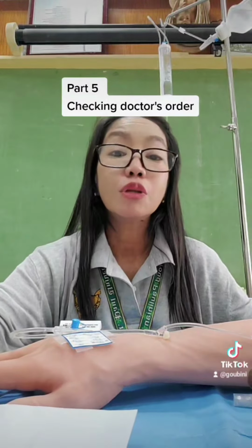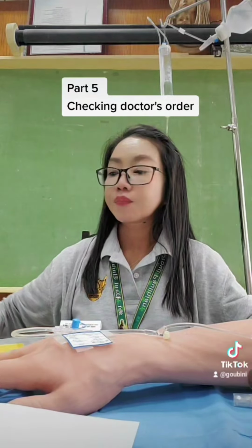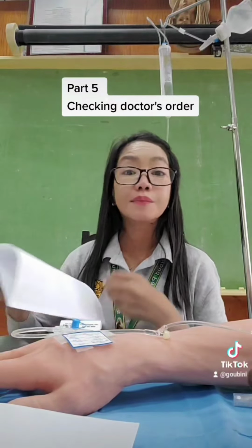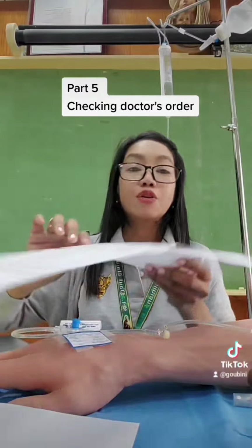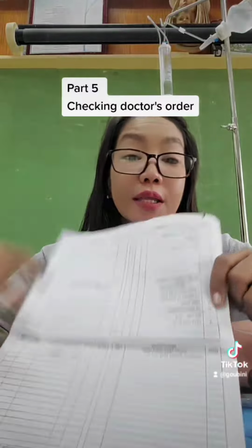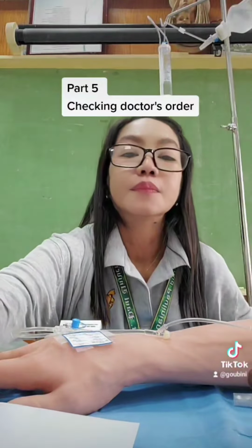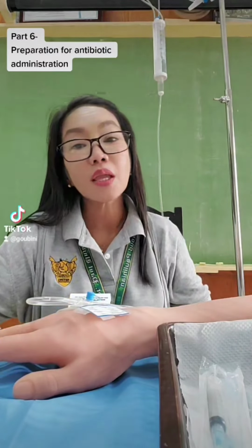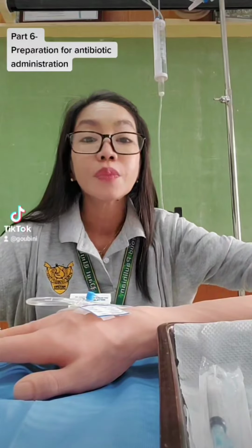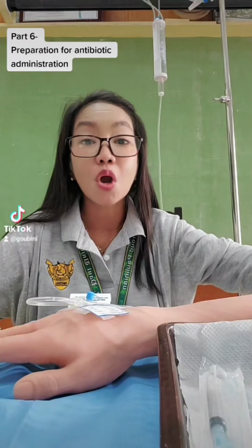After that, you need to confirm in your Cardex whether the right drug has been transcribed in your Cardex. So this is the part wherein you will look for the medication. So let us begin. What are the things that you need after verifying the doctor's order in the physician's order sheet and counter-checking it in the Cardex?